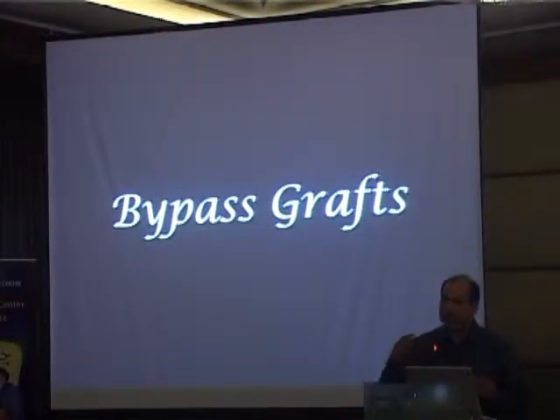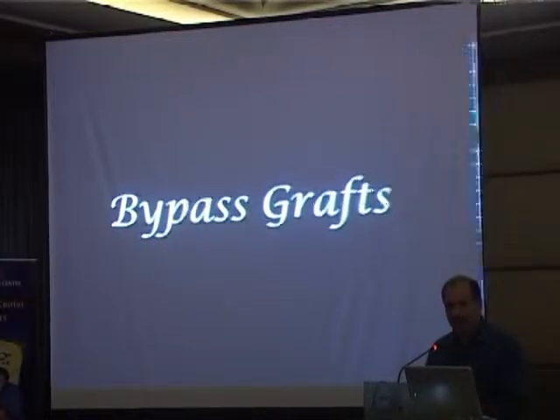So now let's look at clinical issues. I've proven to you that this is a great technology to look at normal coronary arteries. Well, let's look at pathologies now. Bypass grafts. This is something which really brought us into looking at cardiac CT, to see the patency of bypass grafts, which is very important.